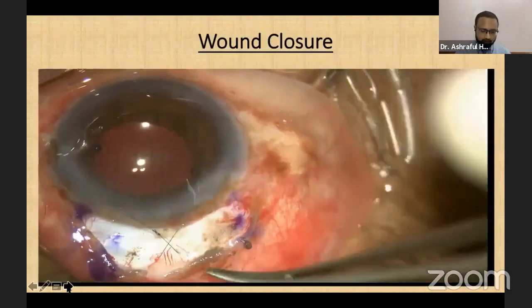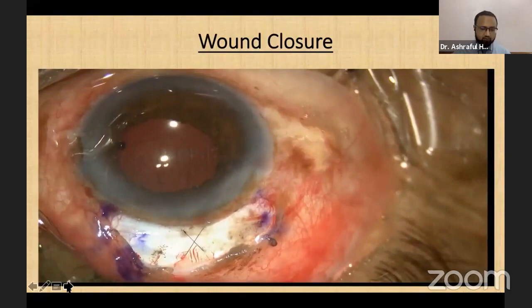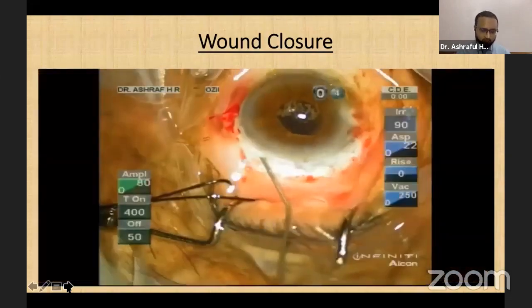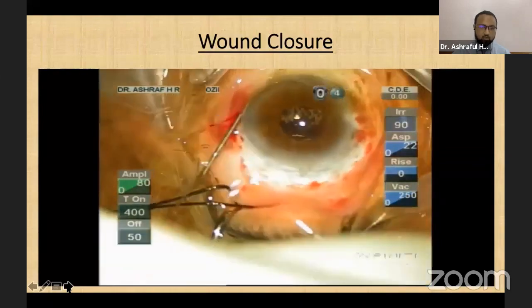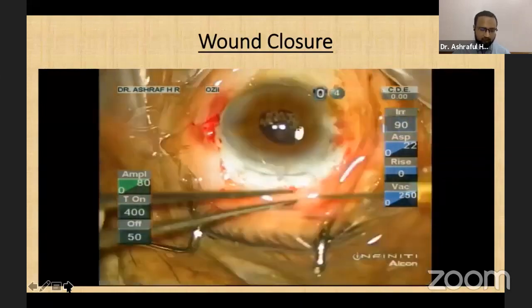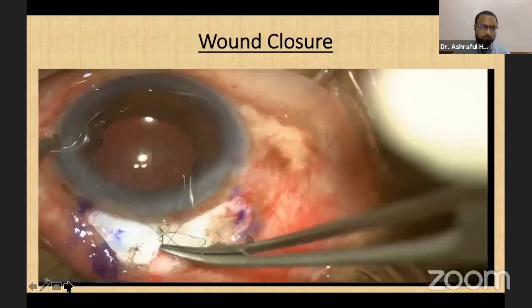Though the incision has self-sealing properties, it is better to give a scleral stitch for very old patients, rural patients or camp area patients to prevent any unwanted traumatic complication. Wound sealing by hydration is done, and after that, the incision site must be covered by the conjunctiva.